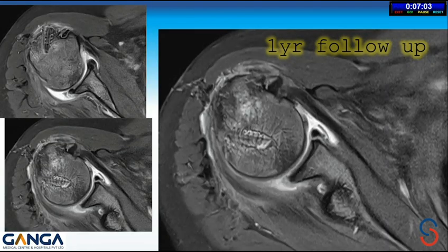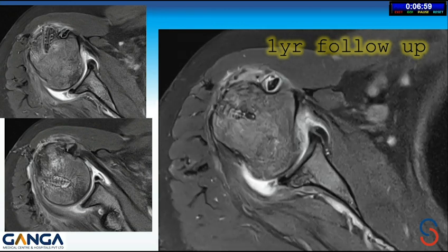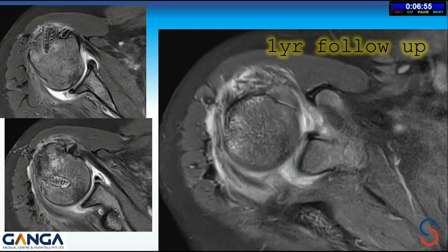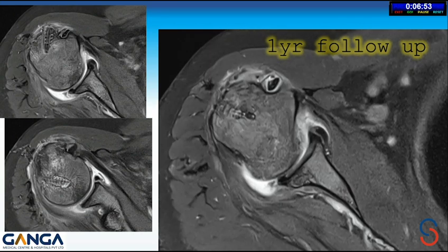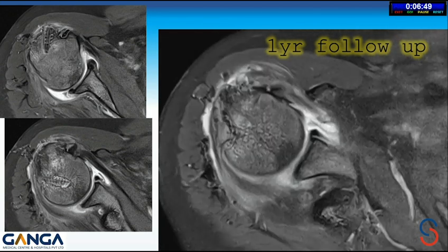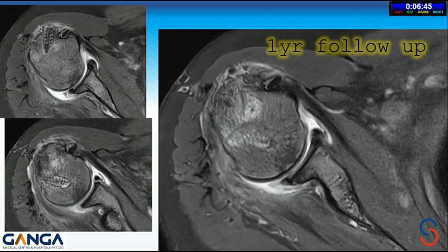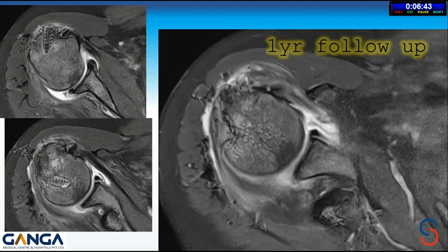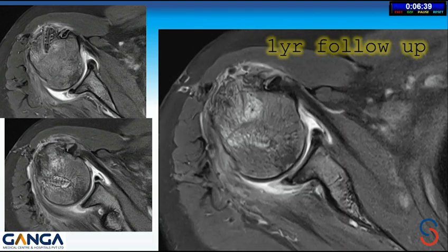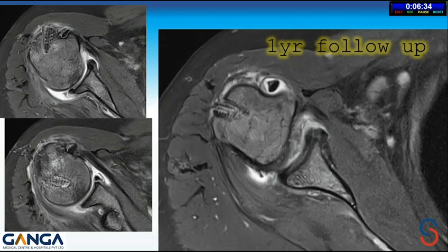Rama, there is a question from Dr. Kapil. Yes, sir. Just a clarification: when we do a normal cuff repair, we expose the footprint and prepare the bony bedding, trying to get tendon to bone healing. In your technique, are you just relying on tendon to tendon healing, because the footprint is still covered with the stump? So how do you get the healing? Because it is a degenerated, hypovascular tendon, are we aiming for just tendon to tendon healing, or is that little signal that you're saying an indication that the healing is not complete?